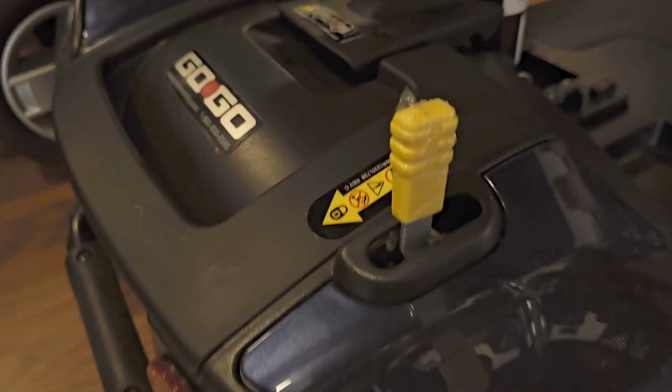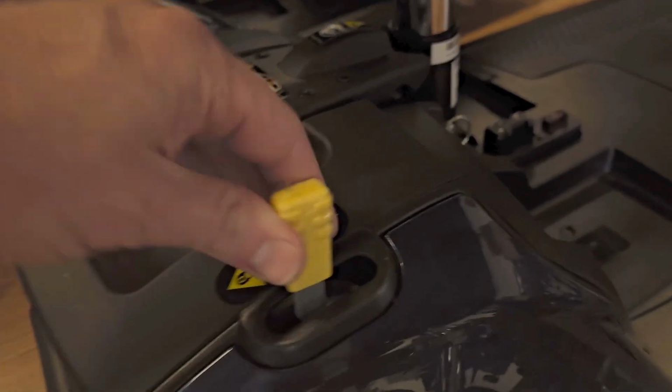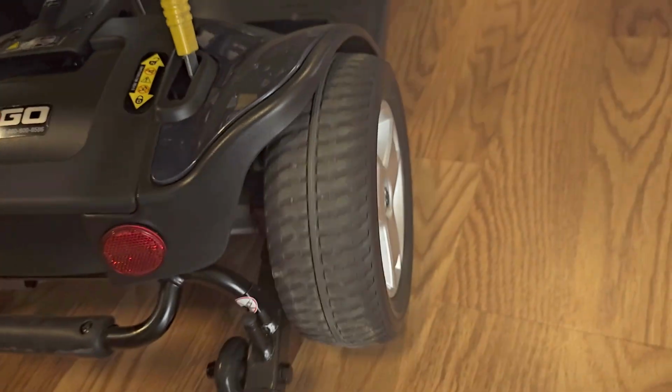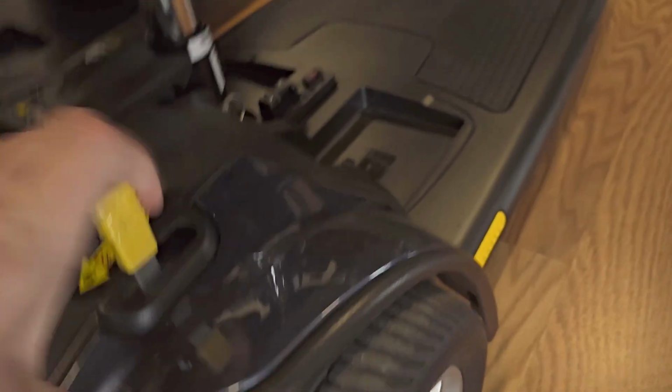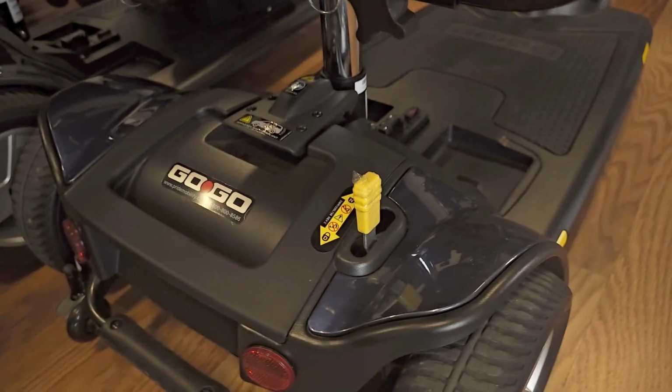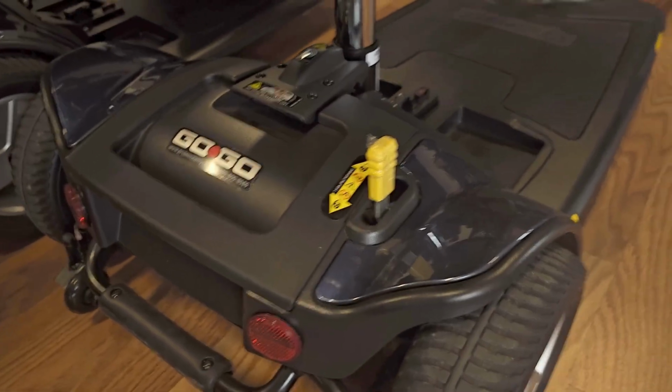Scooters typically have a yellow, sometimes red lever. It's the same idea. So this is in neutral because I can push it. If I powered this on, I'm going to get that same loud, obnoxious beeping and flashing. So something to look for.